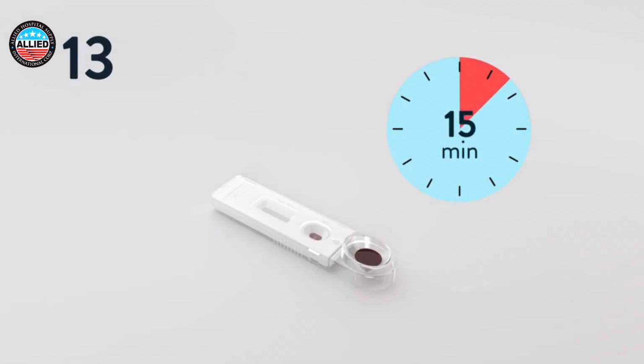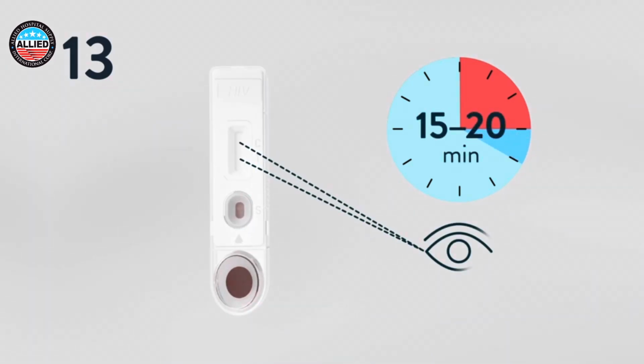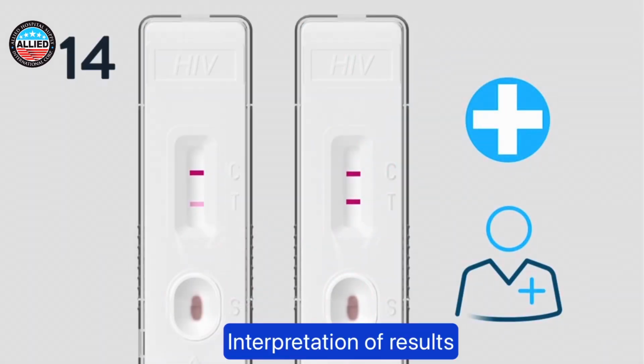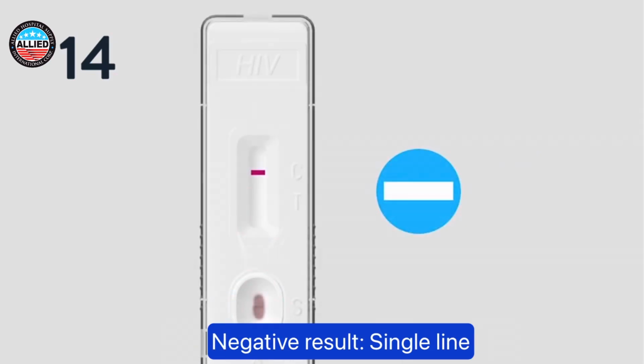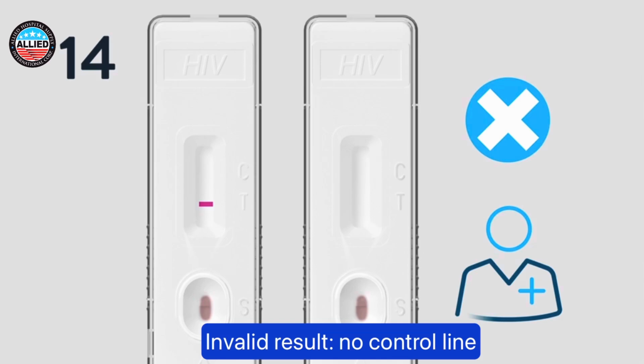Start the timer. Read the result in 15 to 20 minutes. Do not read past 20 minutes. Interpretation of results. Positive result, double line. Any faint line is considered positive. Negative result, single line. Invalid result, no control line.